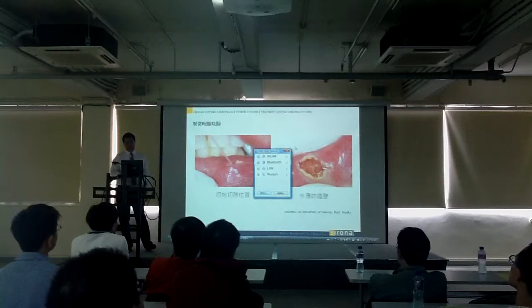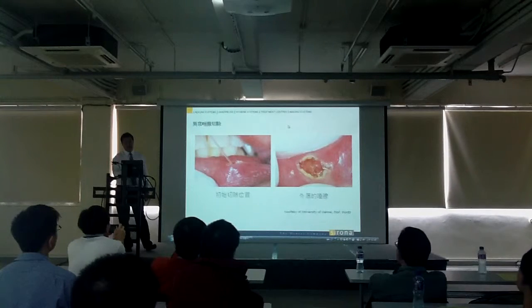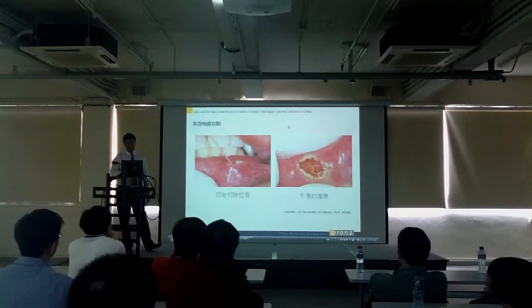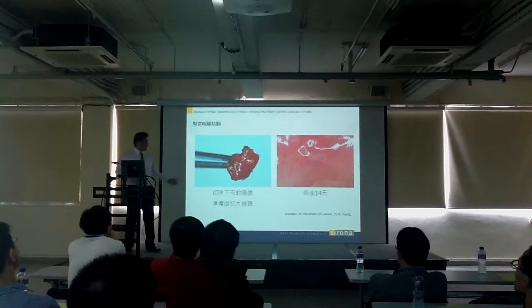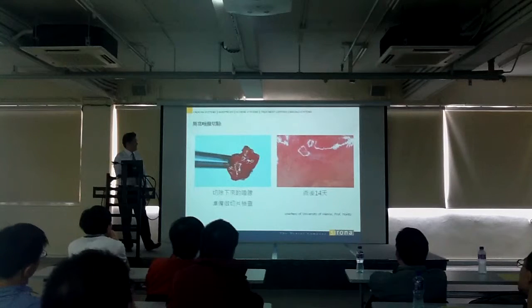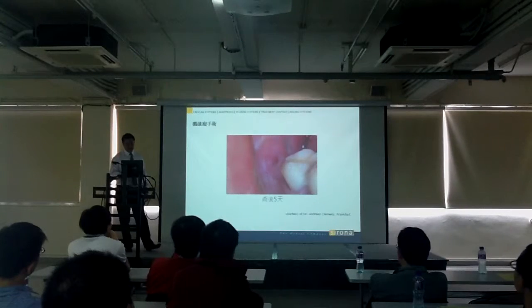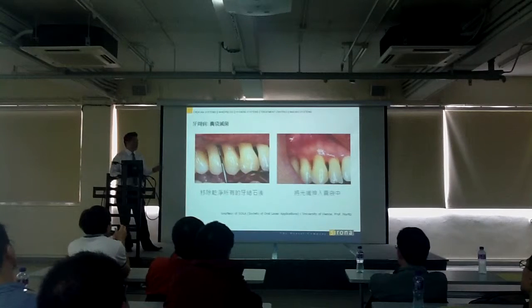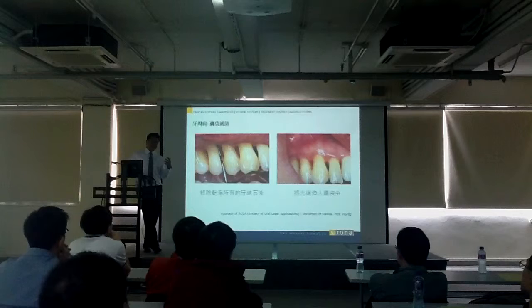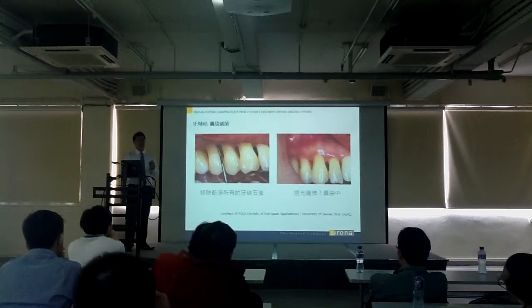Here's a tumor or anomaly on the lip, salivary gland. So basically cut it off, and cut out a good portion for second analysis. 14 days later. Another fibroma. 5 days later. With periodontal disease, or worse, diode laser works in the sense of decontamination, killing the bacteria. It doesn't remove any calculus. You still have to do removal the conventional way.